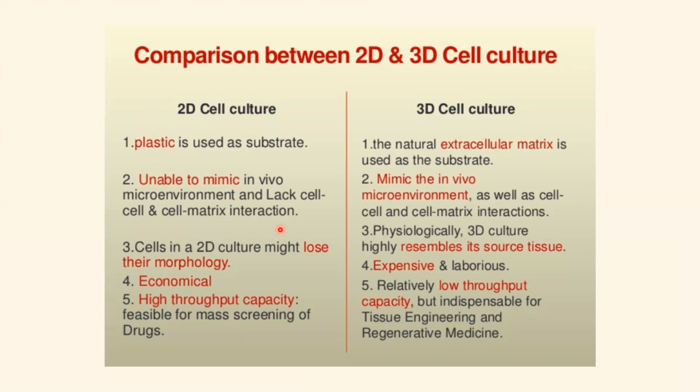This is why a 3D culture mimics the microenvironment that is in vivo, and this natural extracellular matrix is not plastic, it's some other materials, and it's in 3D. This is in 2D.